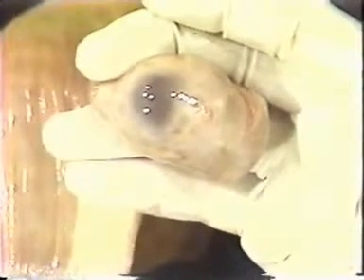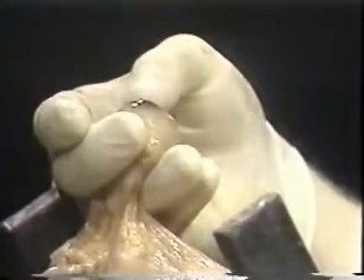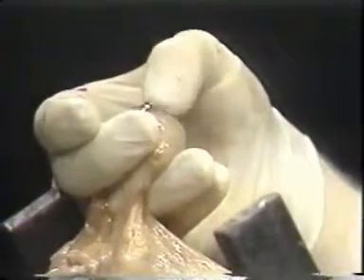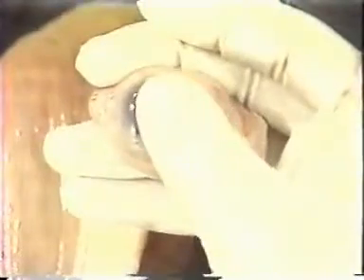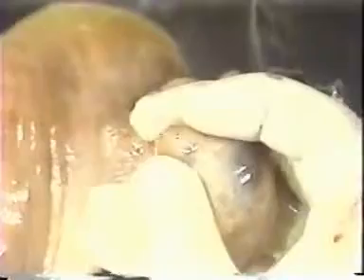In order to more easily differentiate ovarian structures, consider the following. Follicles are essentially a vesicle. That is, if you envision a fluid-filled blister, you have a good idea of what you're palpating. In contrast, the word corpus, as in corpus luteum, means body. That is, instead of fluid, the corpus luteum contains glandular tissue, which often has a liver-like consistency.